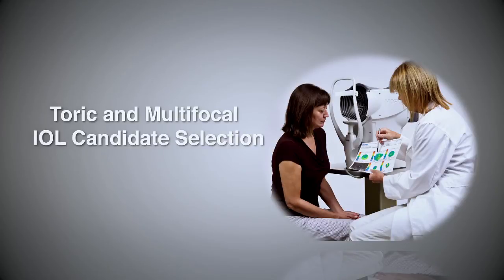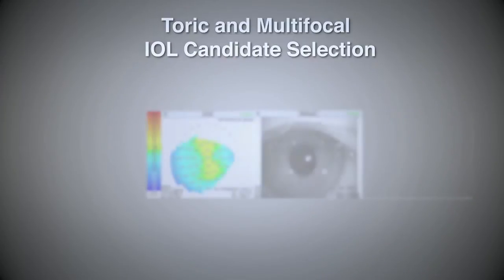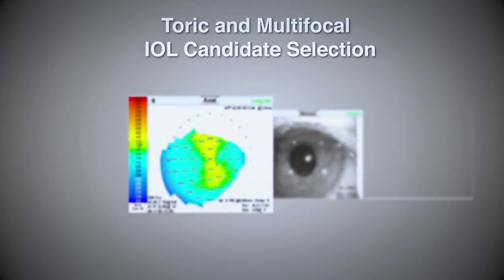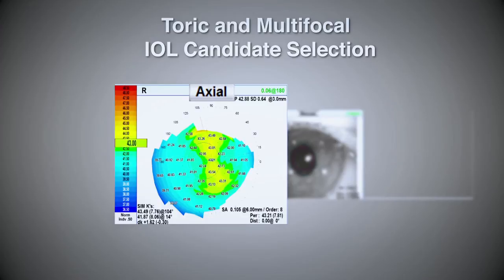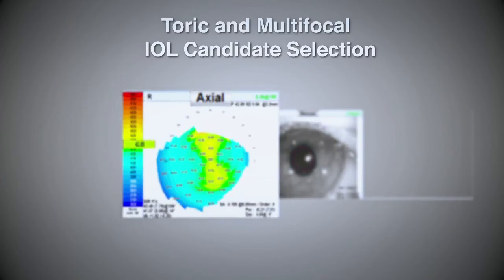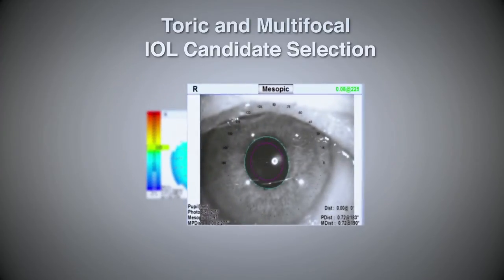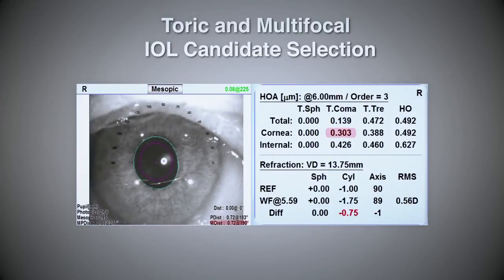The best surgical outcomes can be assured when implementing premium and toric IOLs with the OPD Scan 3. The axial map can be used to determine if a patient is a good candidate for a toric IOL. Checking the angle kappa and corneal coma will help best select multifocal IOL candidates.